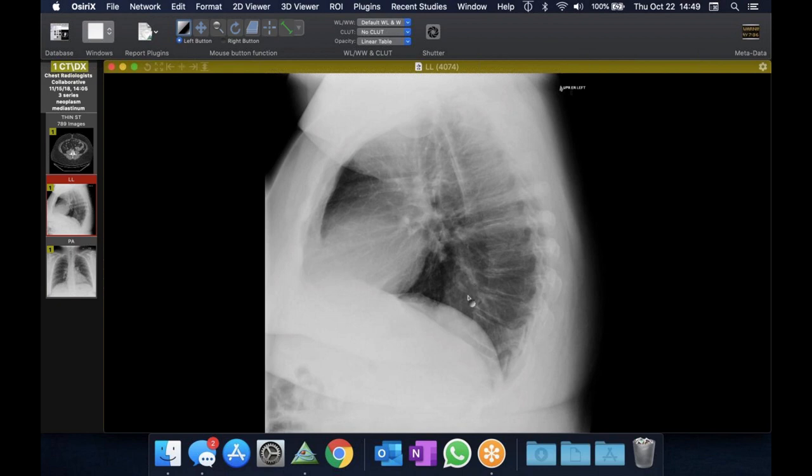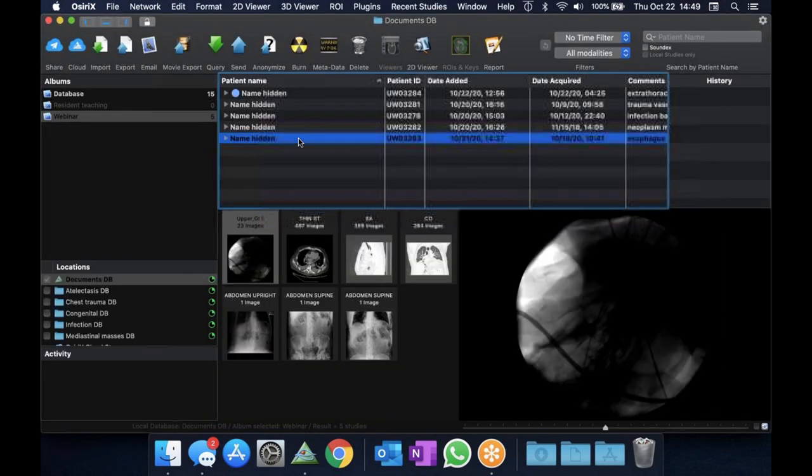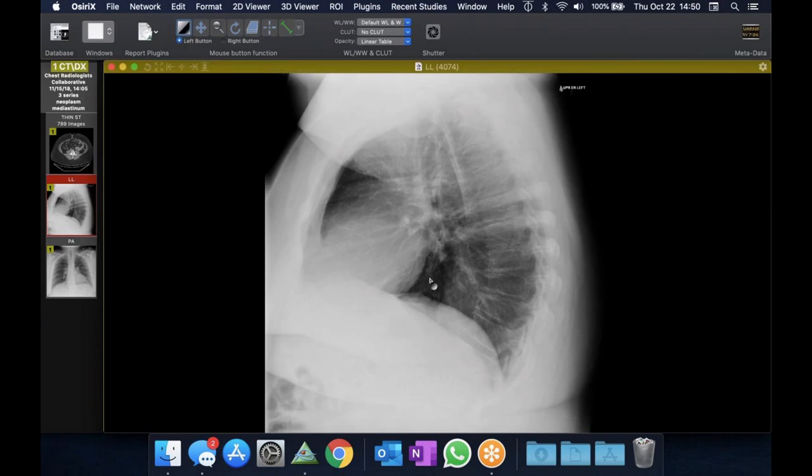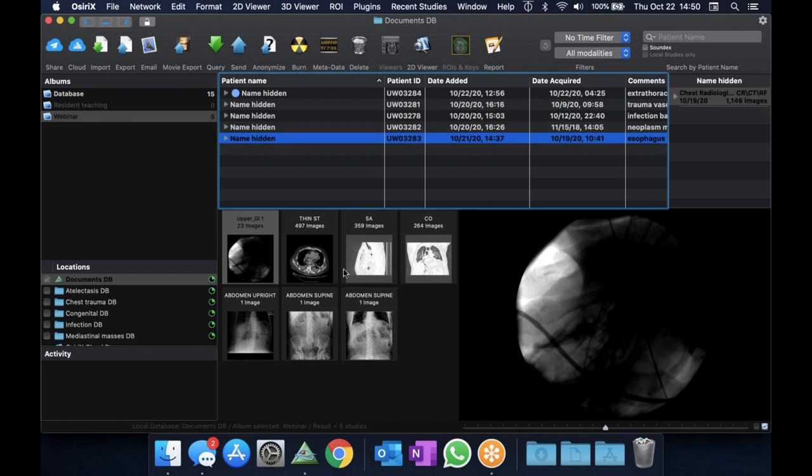It's a little full back in here, but it's fat. I don't know if that's probably just all aorta anyway, since it was paraspinal. So just a fun case. Hiatal hernia, you know, is also on the list for that. Right. And sometimes they just contain fat. But the thing about hiatal hernia is it will obscure the back wall of the heart. And in your case, the back wall in the lateral view was very crisp. So it wasn't hiatal. True. Good point.